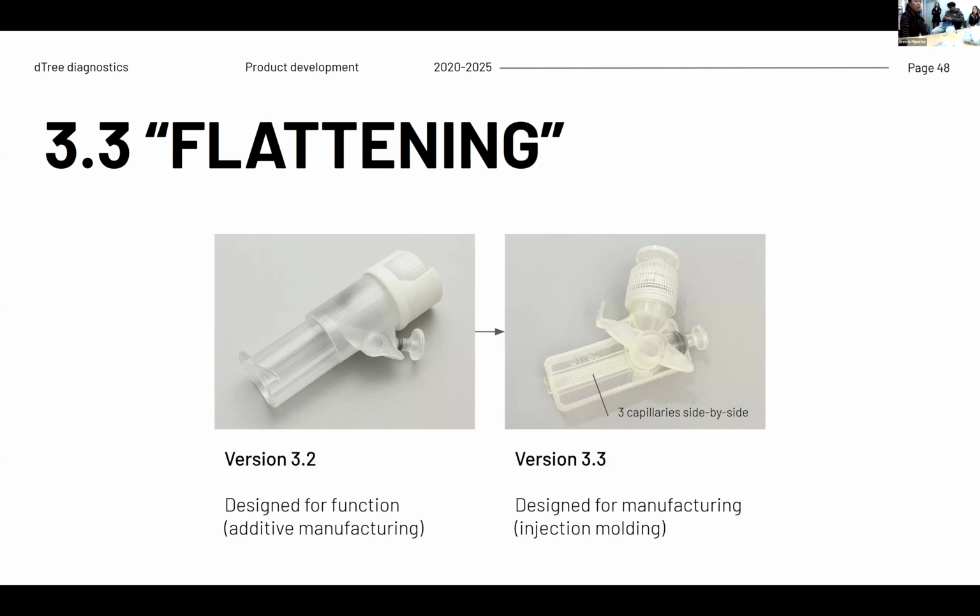So when we lyophilize, we also lyophilize in the capillary. We try to make the volume so low, in terms of the water content even before the lyophilization, that the dry content is very small. Ideally, this would be in a pellet. This can be done in a company, just not right now, not at Stanford by us. We need different mechanisms for this, but for what we can do for our testing, we can dry them as small as 2 to 3 millimeters worth of capillary.